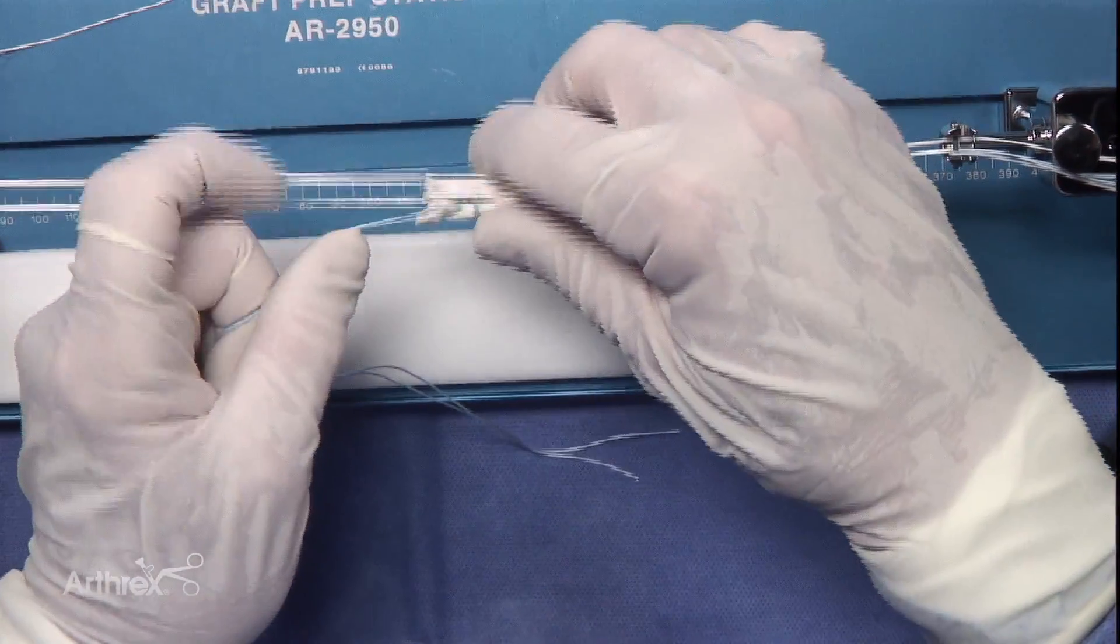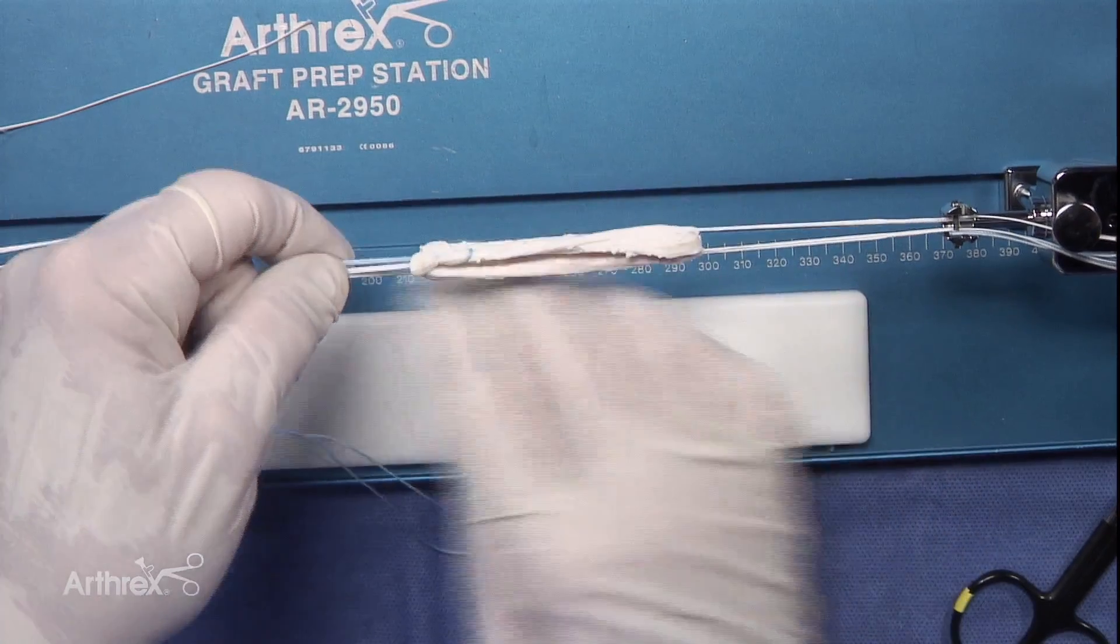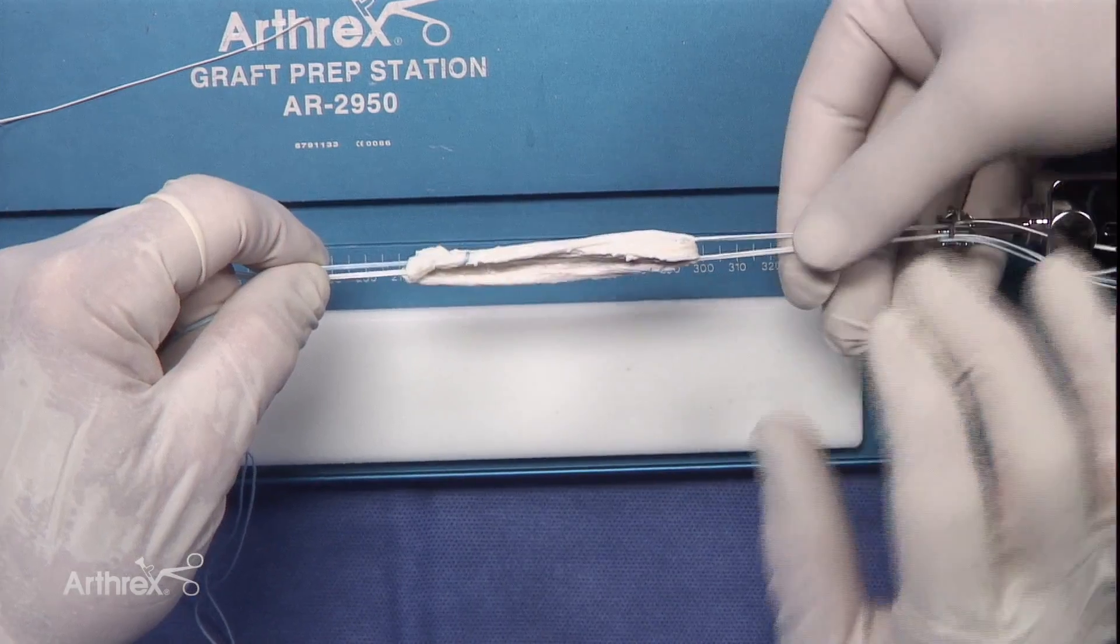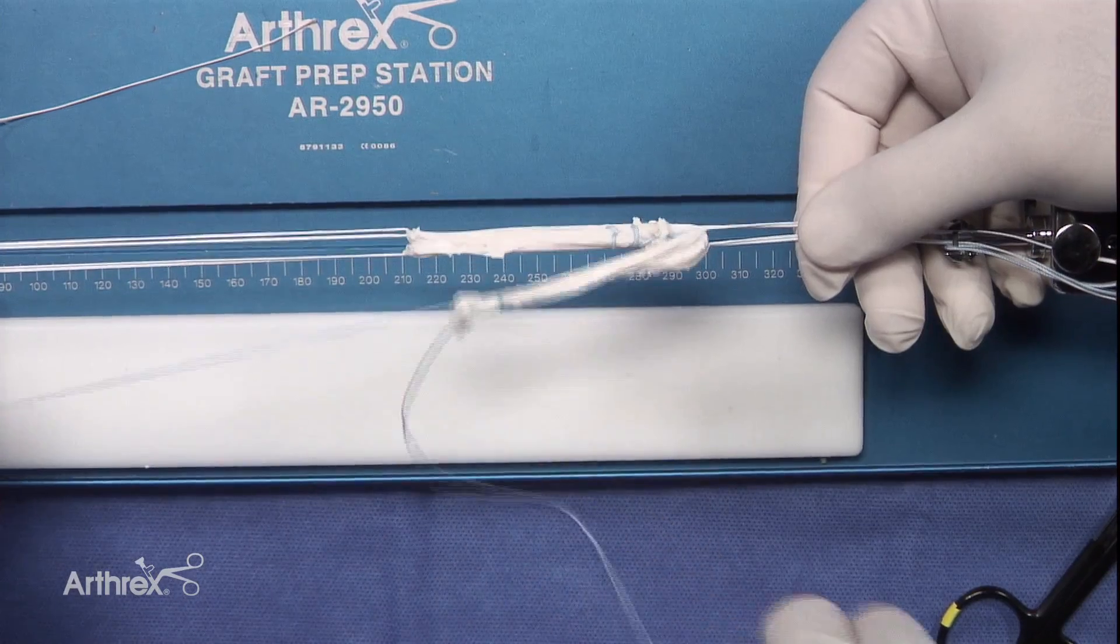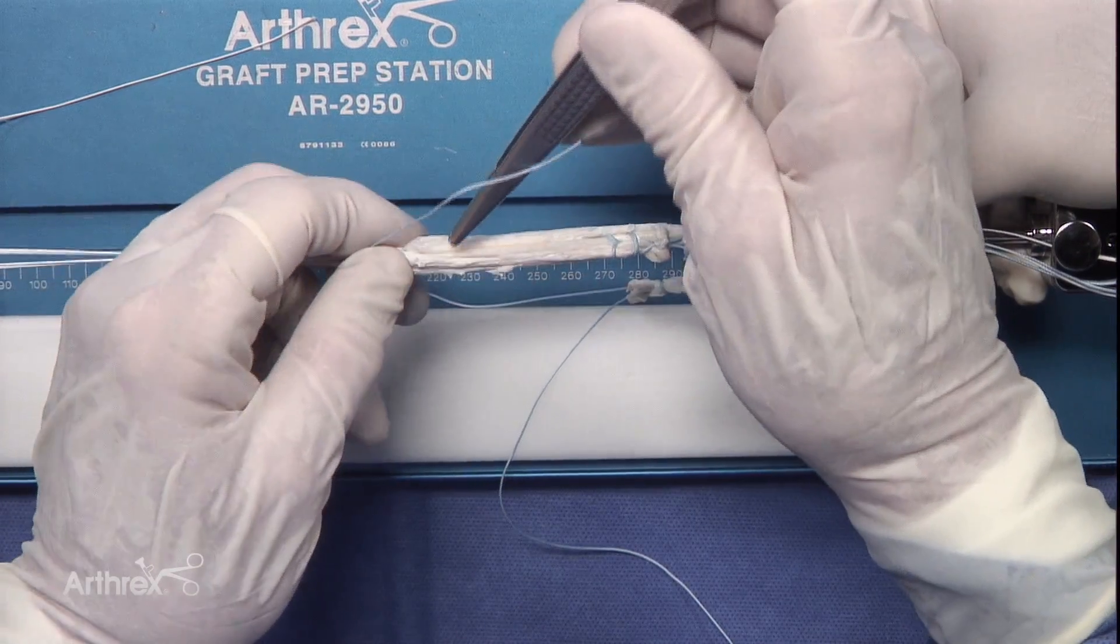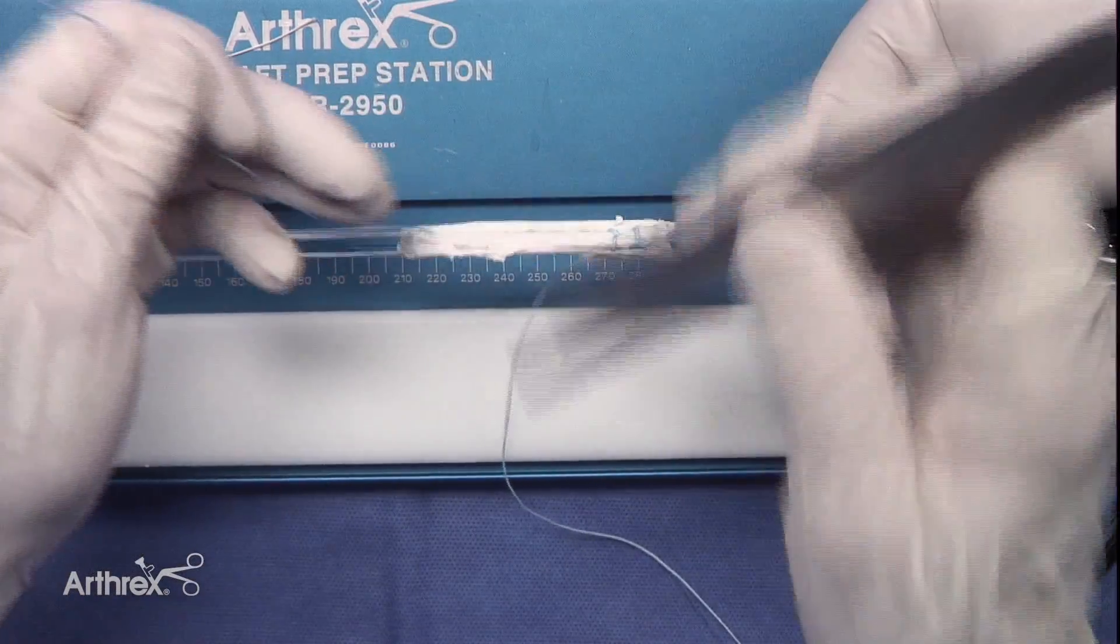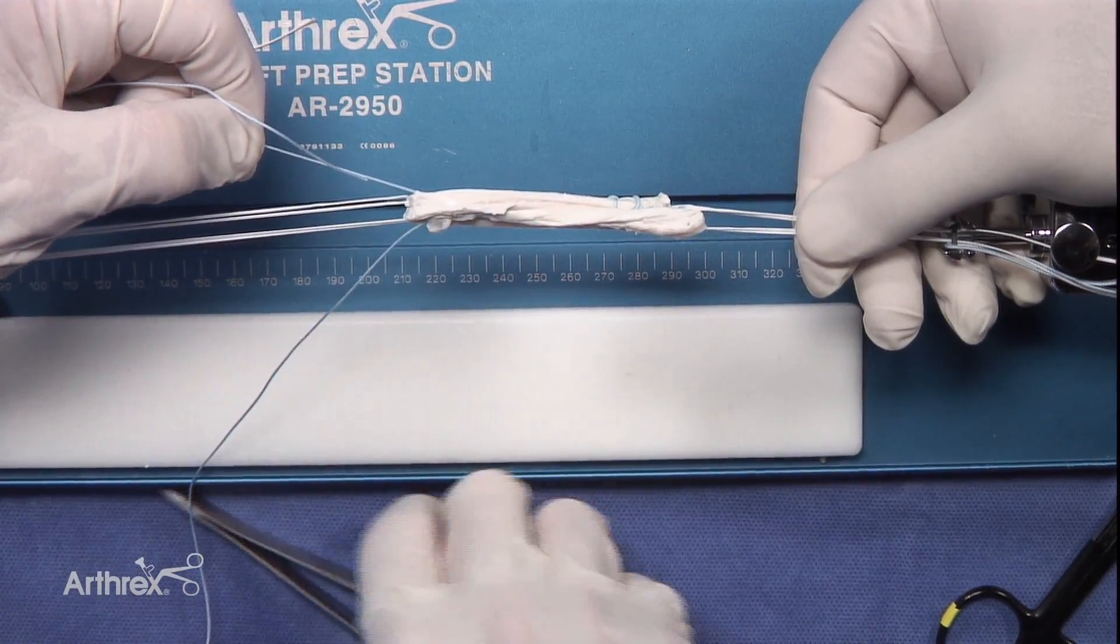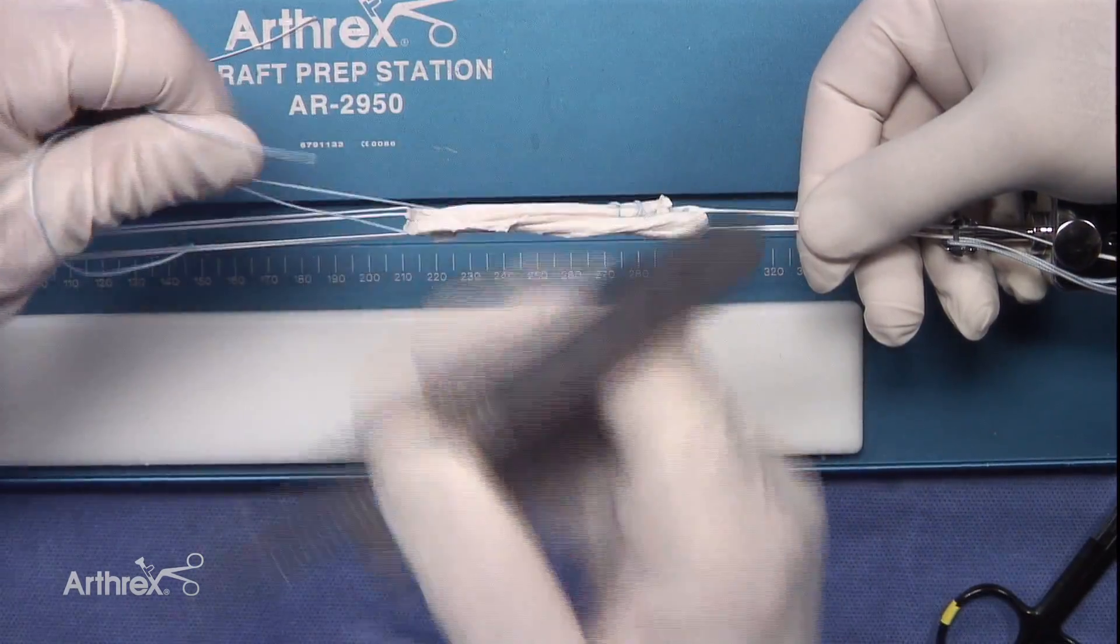Here's the final adjustment in the length. The construct is coming together very nicely. Put a little tension in that, and then we'd like to tuck this final end into the center. Once in the center, we're going to tie it there.